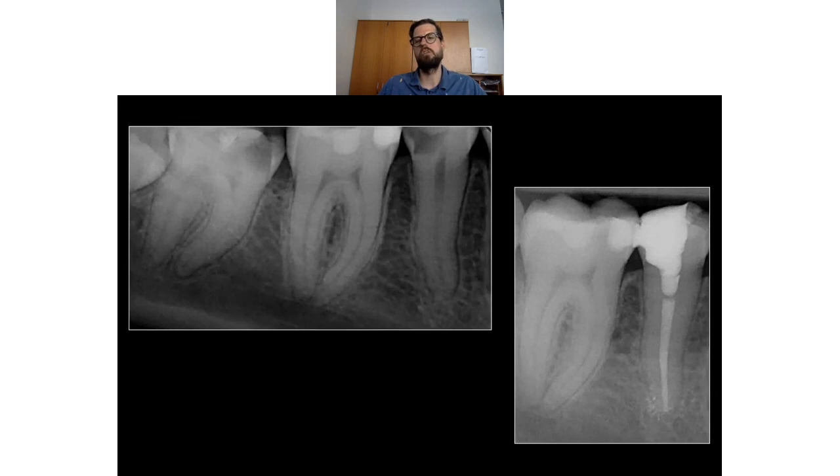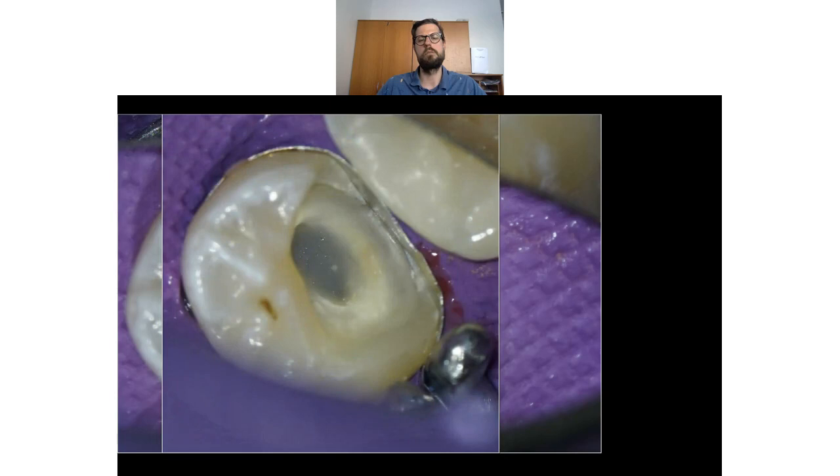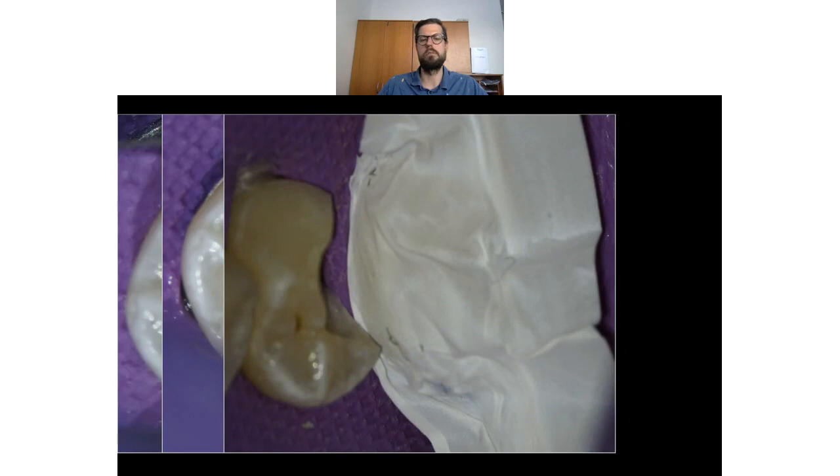But when the patient came for the filling, this was the situation. So the whole cervical margin broke subgingivally, and now you have this kind of situation. So you see that half of the premolar is preserved, so we don't have to put a crown there, and the lady is very young. So here is the problem: if we wedge it now with the partial matrix, we will have a problem. So we sandblasted it, and then you put a circular matrix around it, and now you just elevate the margin. And as you elevate the margin, you must protect the neighbor teeth, for example with Teflon tape, so that you don't etch it.